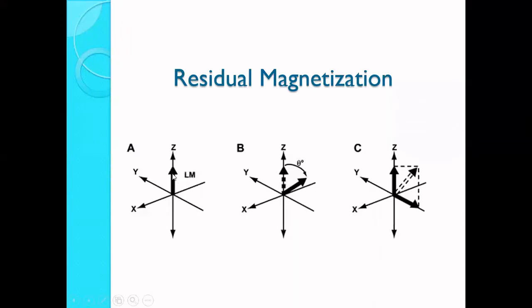So the longitudinal magnetization is shifted when we give an RF pulse of theta degree. What happens? This longitudinal magnetization is shifted toward the transverse magnetization, to another plane, this plane. So this shift happens. If you shut off this RF pulse, what happens? This transverse magnetization recovers toward the longitudinal magnetization, but it doesn't recover to its full capacity, like the earlier longitudinal magnetization.